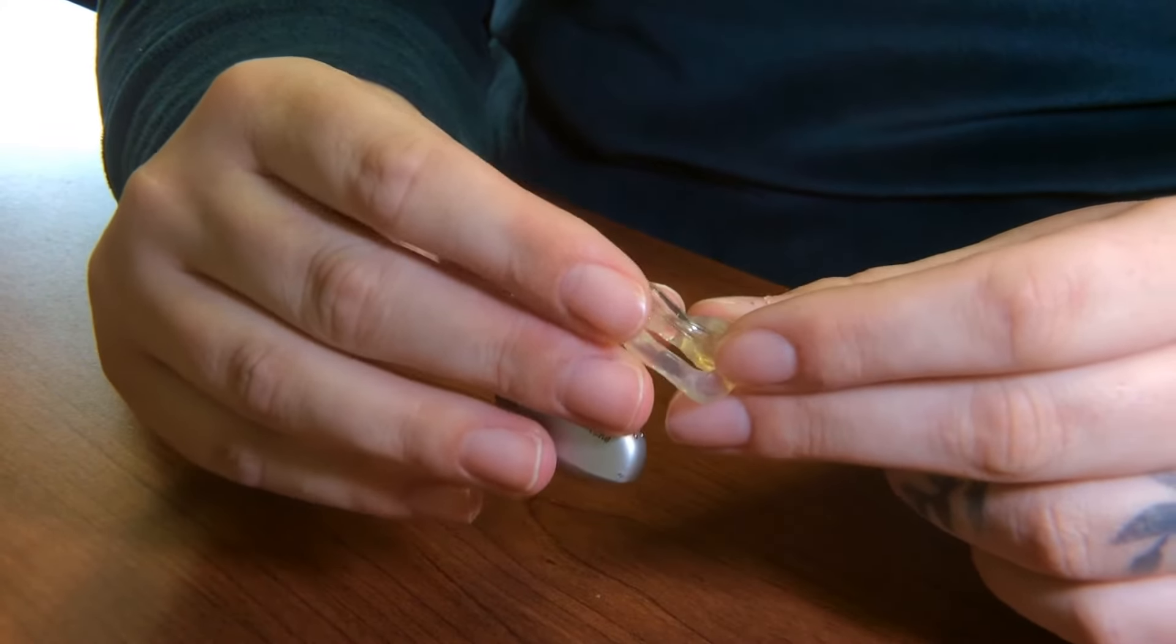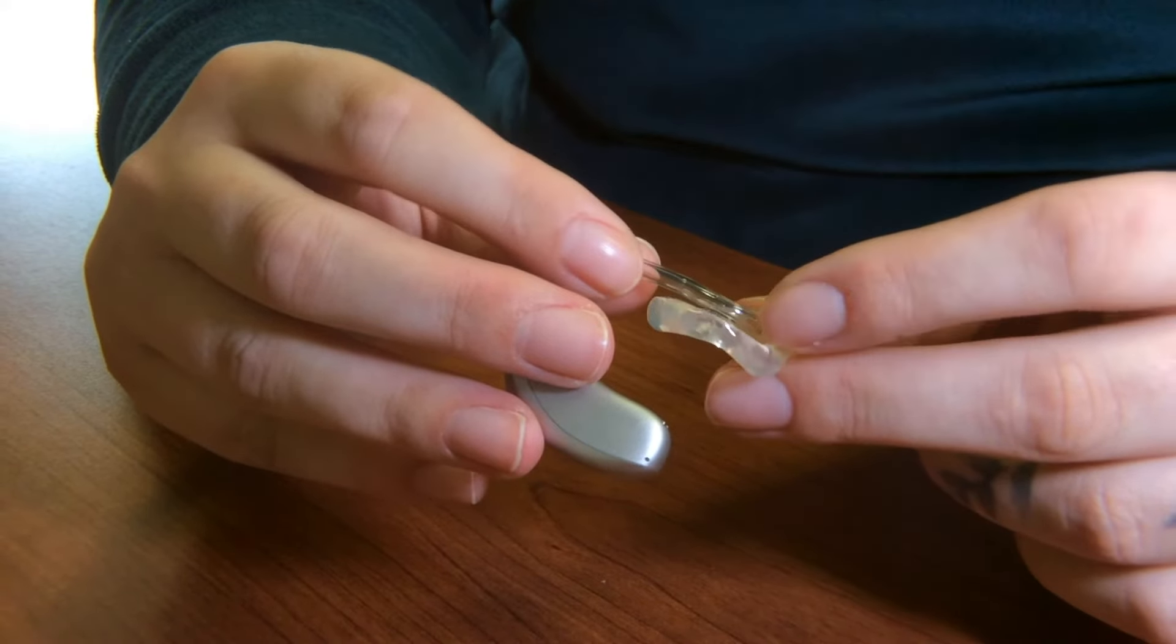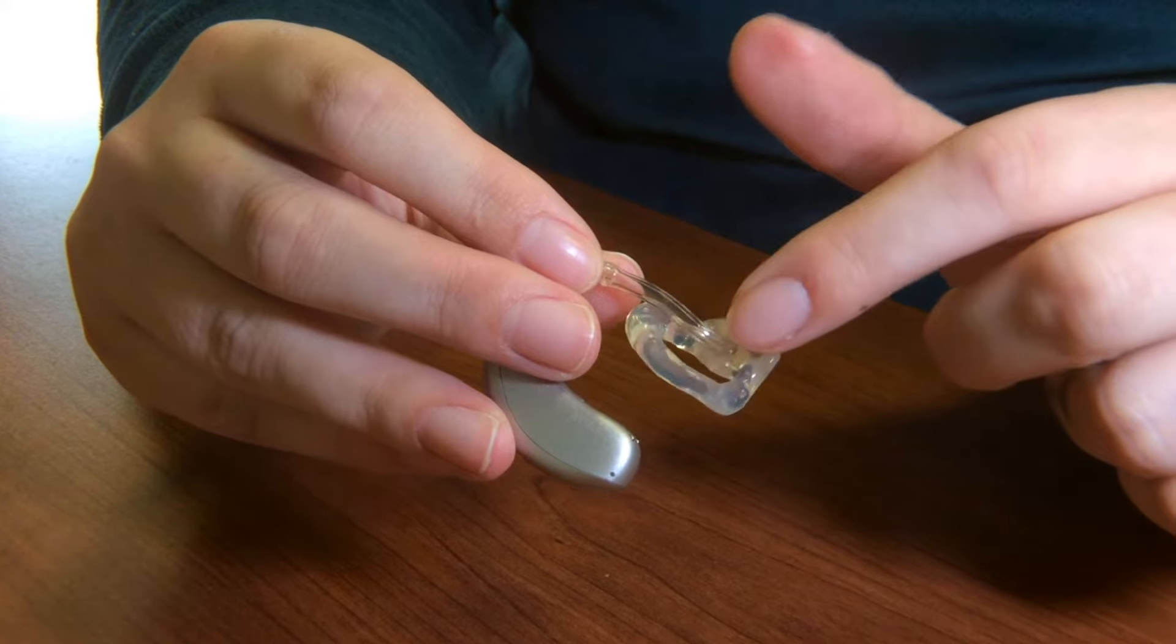Once you've cleared the ear mold, then you want to look at the tubing and also check for any kind of cracks, any kind of moisture, or any kind of blockage in the tubing itself.